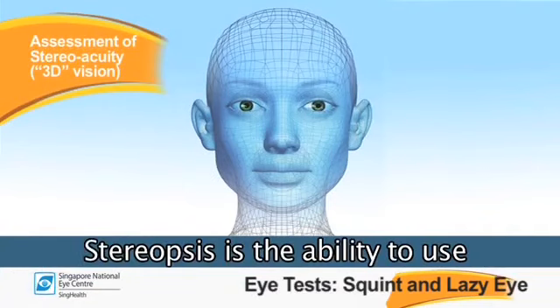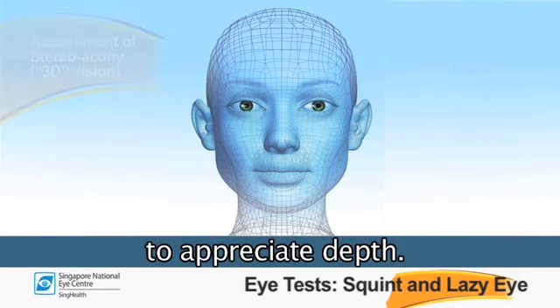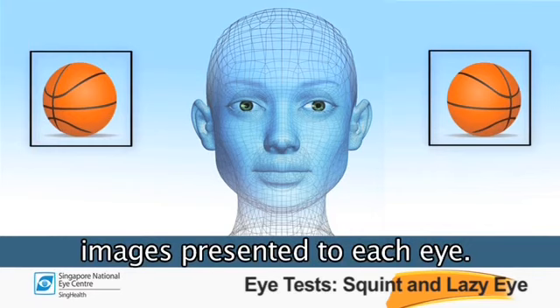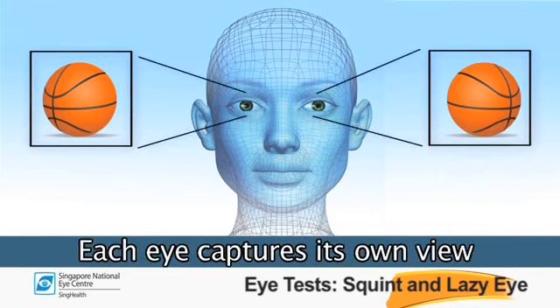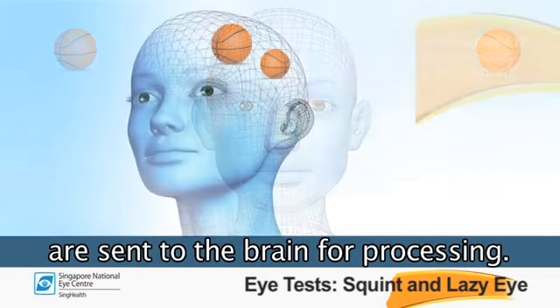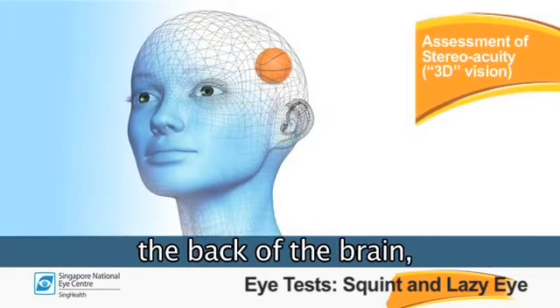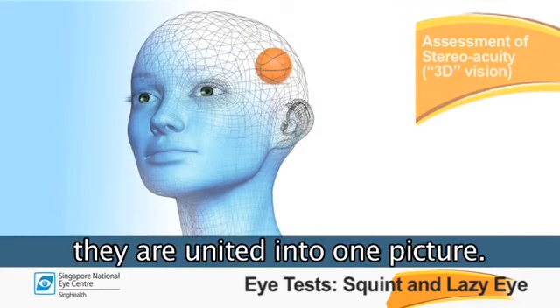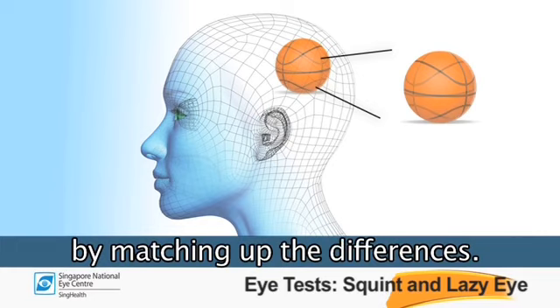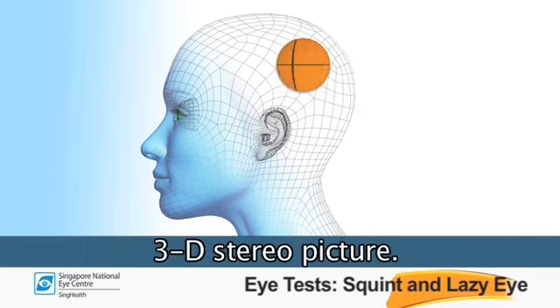Stereopsis is the ability to use both eyes together to appreciate depth. The test involves slightly different images presented to each eye. Each eye captures its own view, and the two separate images are sent to the brain for processing. When the two images reach the back of the brain, they are united into one picture. The brain combines the two images by matching up the differences. The combined image is a three-dimensional stereo picture.